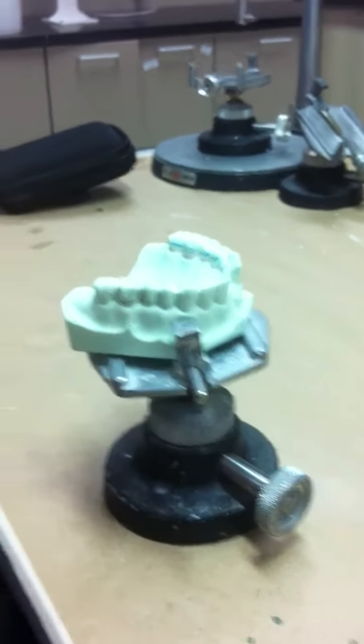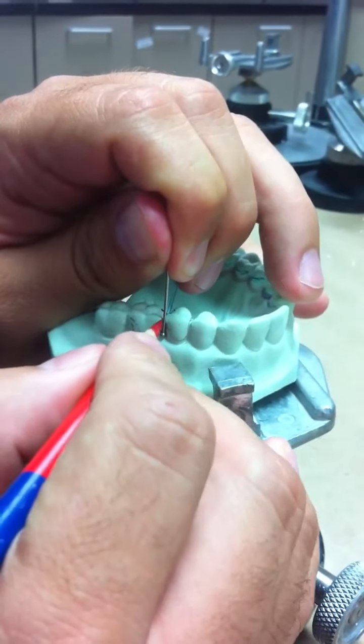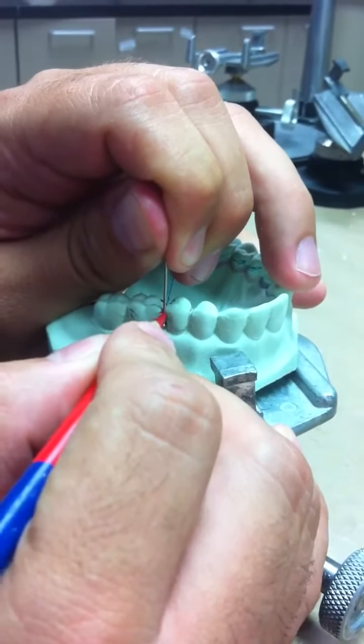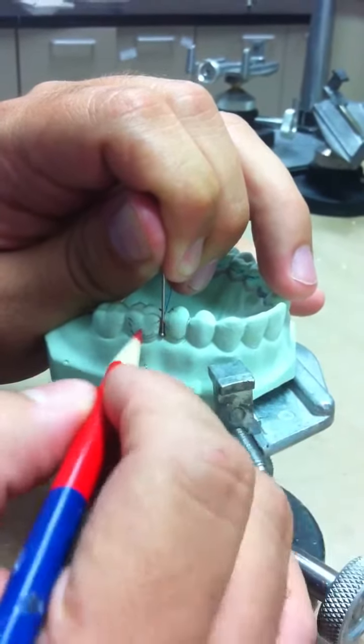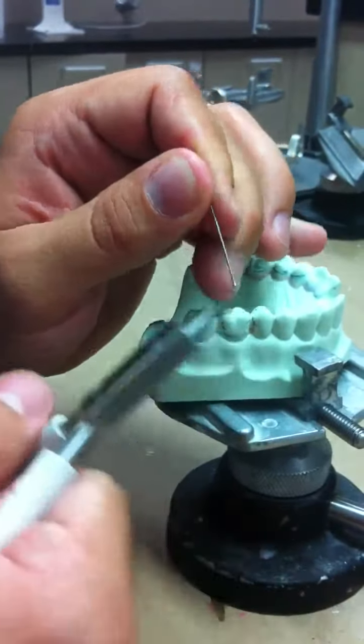This is a ball clasp. We are taking the ball clasp and placing it between the embrasure of 13 and 14. Marking it with a red and blue pencil as to where we will be making the bend.